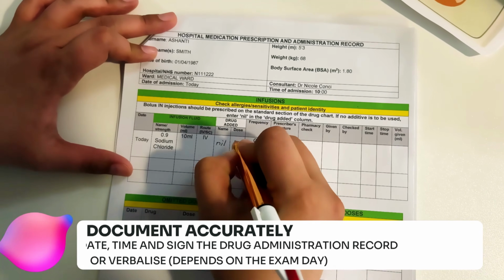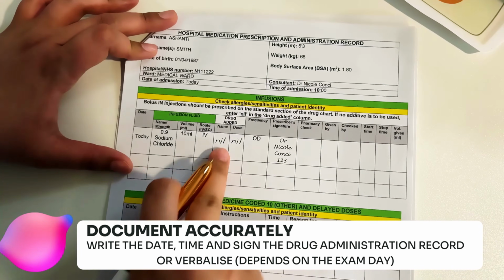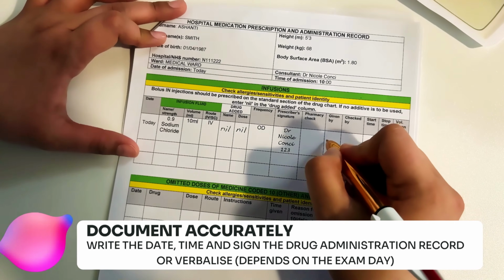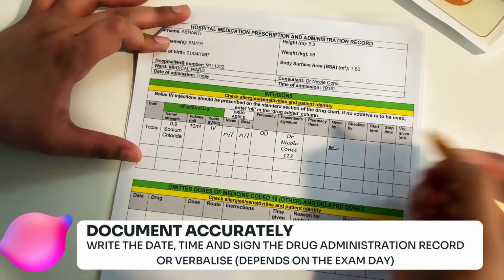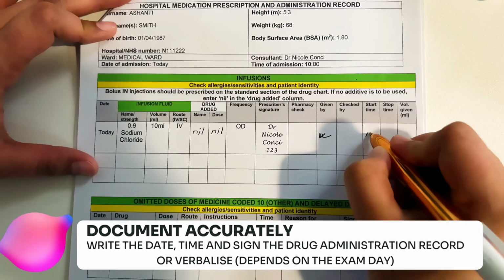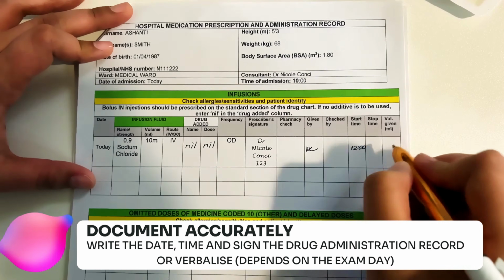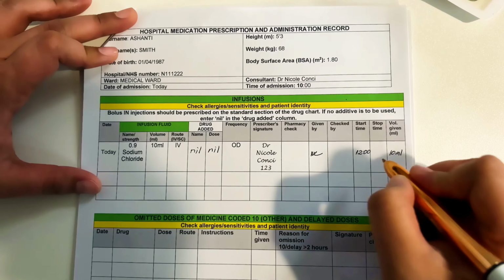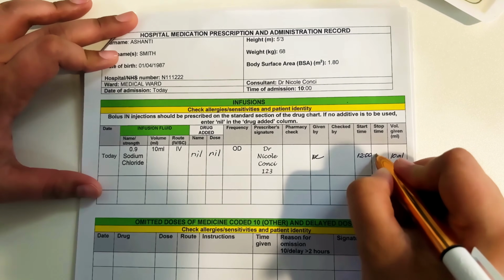Okay, this one is right here. Pharmacy check, given by. Okay, checked by. Start time is 12. Volume given 10 ml. Okay. So I am done with the documentation.